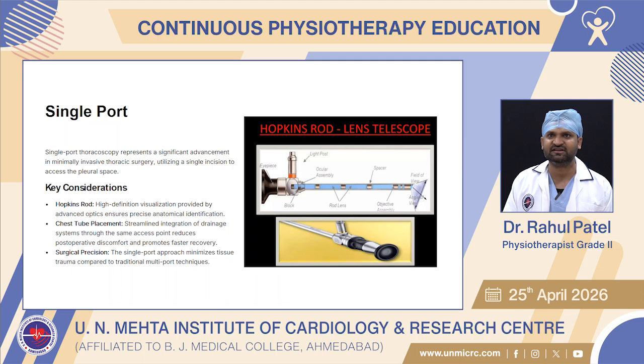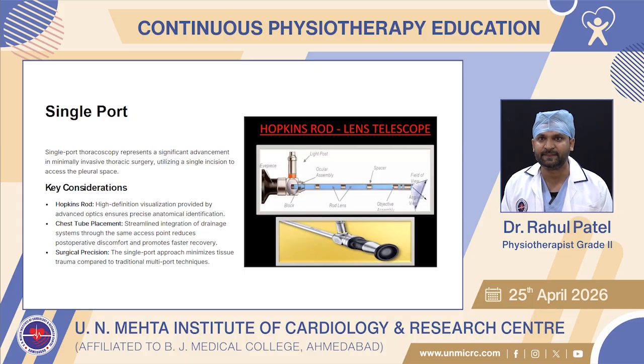Single port, Hopkins rod and lens telescope. Let's see the image. Single port thoracoscopy represents a significant advancement in minimally invasive thoracic surgery, utilizing a single incision to access the pleural space.